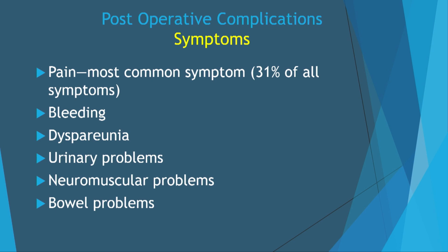Well, in my practice, actually, the vast majority of patients are coming to us because they have some kind of possible post-operative complication. And unfortunately, this group of patients has received a great deal of publicity in the press and in the legal societies. So actually, in our area, there are law firms that advertise for patients. So it's certainly an area that you should be very, very familiar with and be very careful whenever you do these exams.